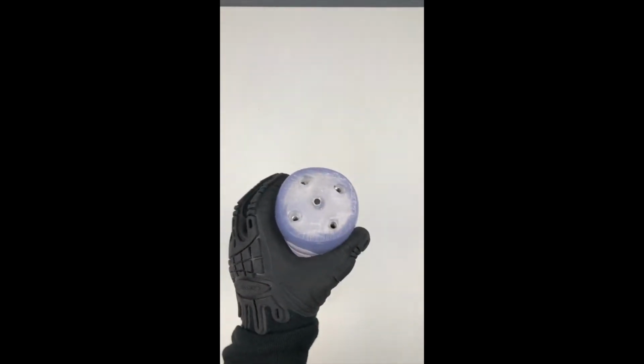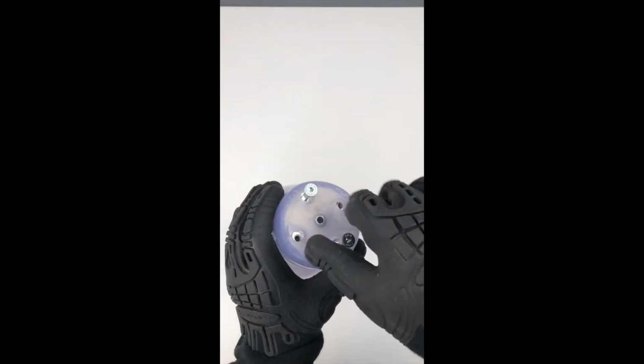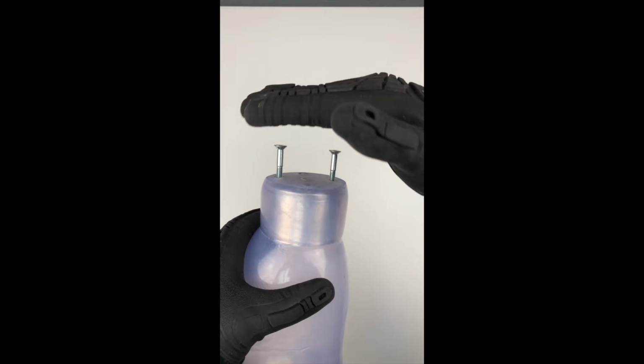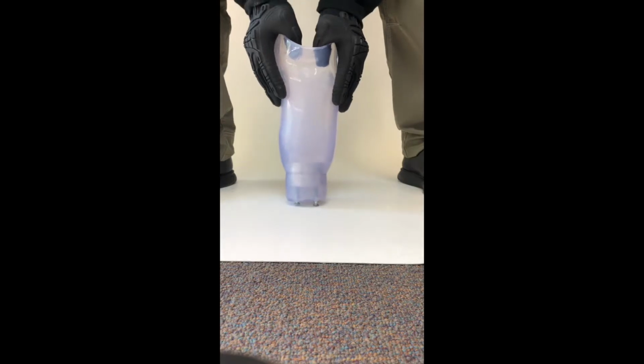Install at least 2 40mm screws into the distal aspect of the molding dummy. This will facilitate removal of the dummy. Ensure the screws are even. To remove the molding dummy, simply place the socket on the floor and apply your full body weight.